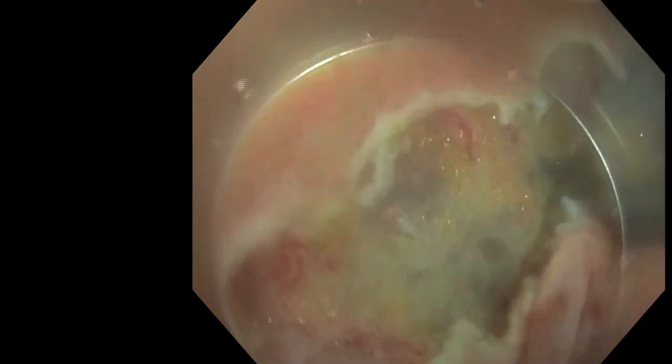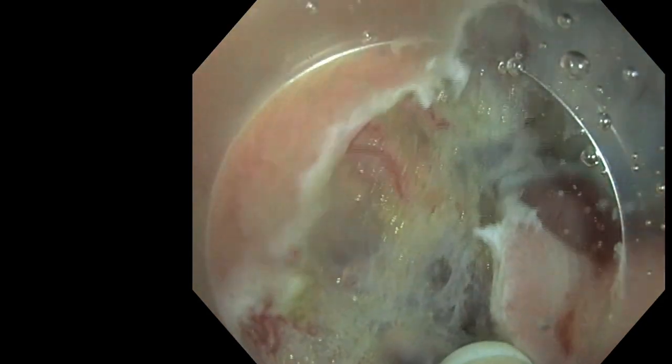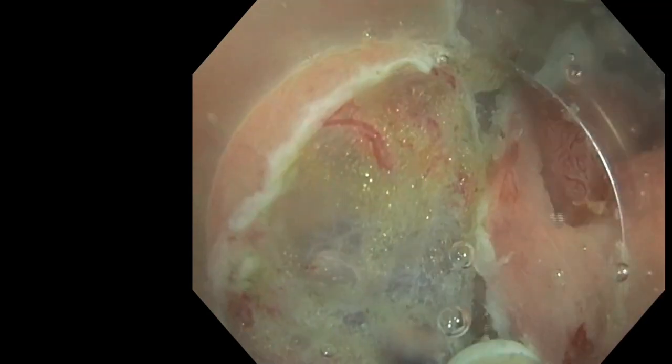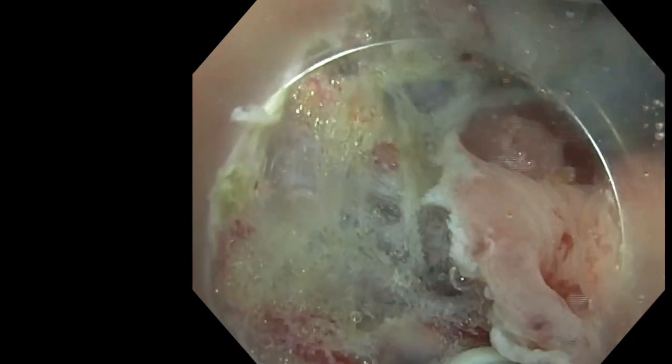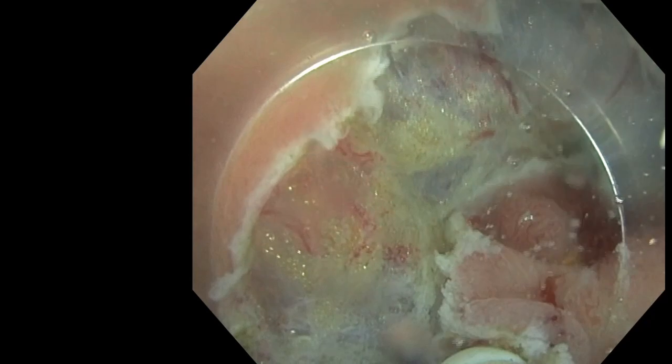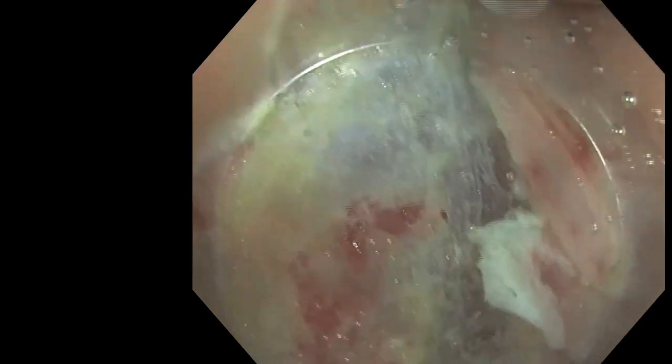So here it's a little difficult to go under. The area is quite small, the space is not very large. But by doing the trimming, using underwater strategy when needed to make the edge floating, it's a little easier to open the space.